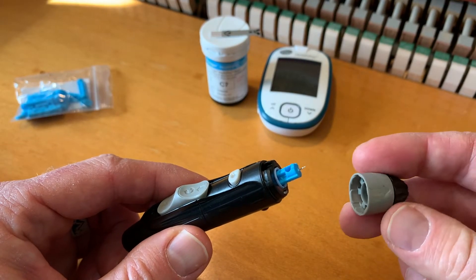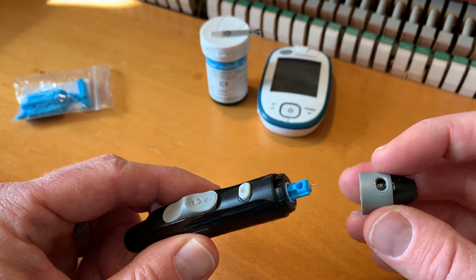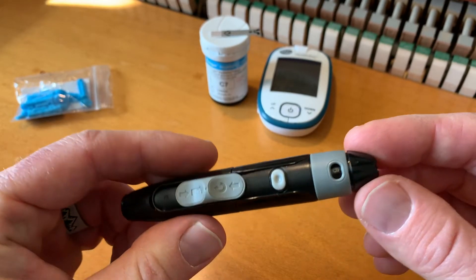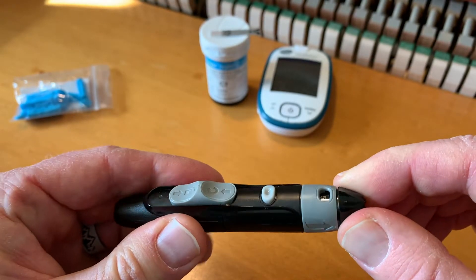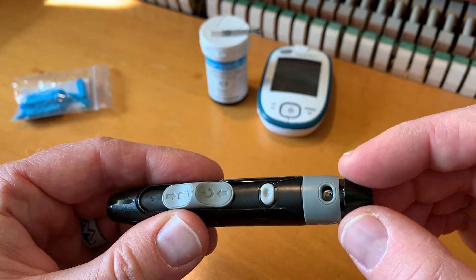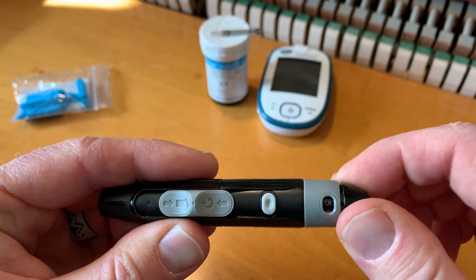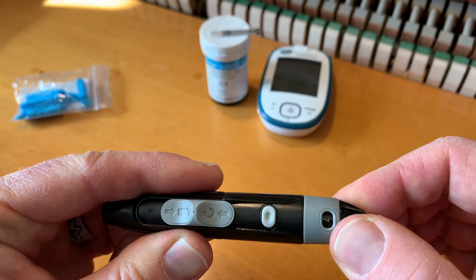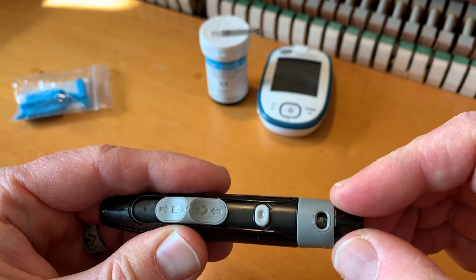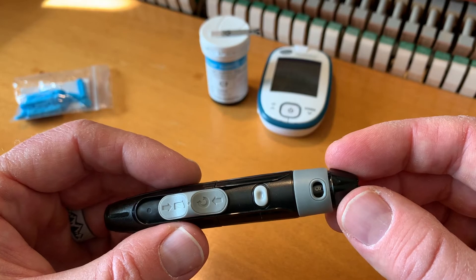Once we have the needle exposed, we can put our cap back on. We want to make sure the little numbers on the front — this is our depth gauge — are towards the front. Push it straight in and you'll hear it snap closed. At this point, we're going to twist our little numbering system to get to the correct setting. For soft skin you can go to a really low depth gauge — just a short little prick. If you have calloused fingers, you may need to go a little bit deeper. This goes all the way up to nine. I usually keep mine at around six or seven — a basic medium range — and this seems to do the trick.